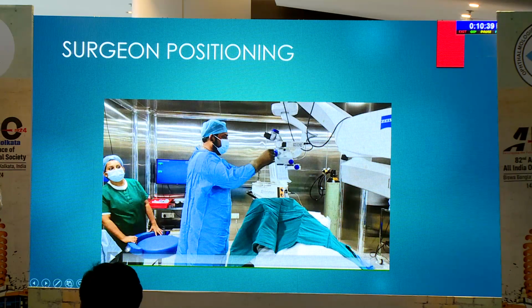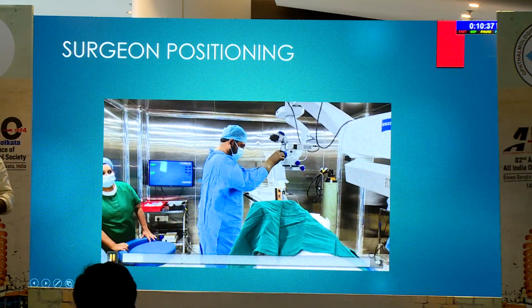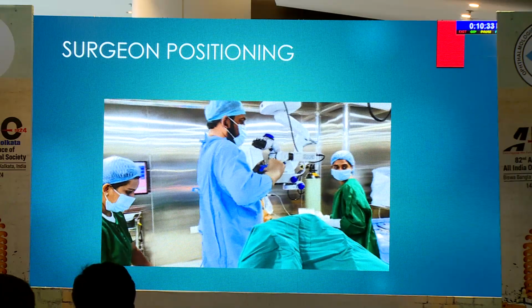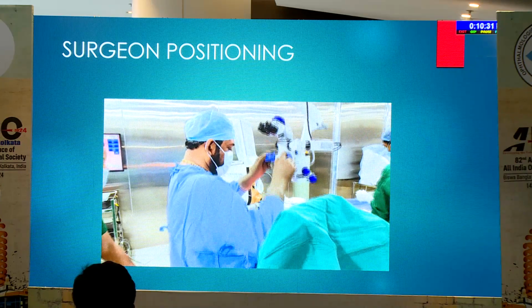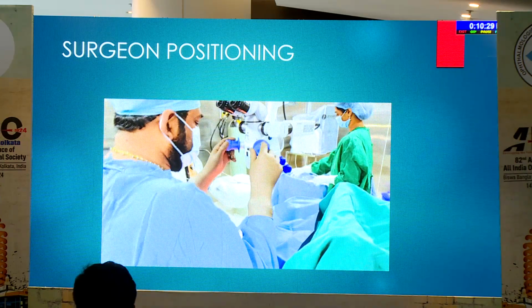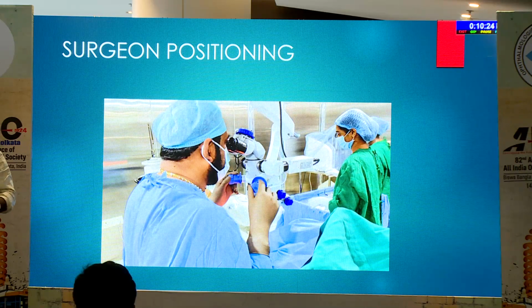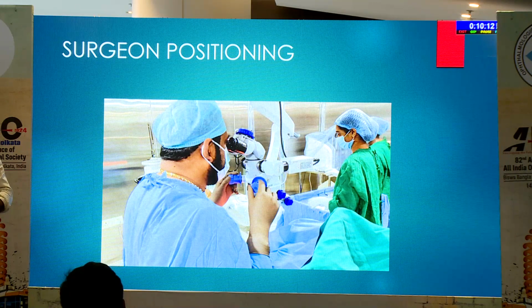Again, very important is the surgeon's position. Now we have made the head position in such a way that the head is parallel. You have to look at the chin. It is not tilted up or tilted down. So make it in such a position that it's comfortable. Now make sure the surgeon also sits properly. He is neither leaning forward nor away. It should be in the ideal position. You can also adjust the microscope, the tilt, and make sure most of the time the knob of the lighting position will be halfway through.